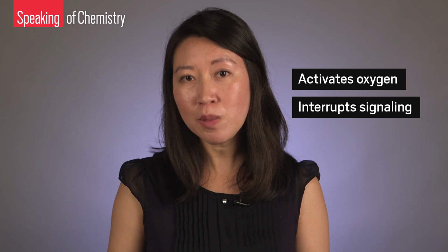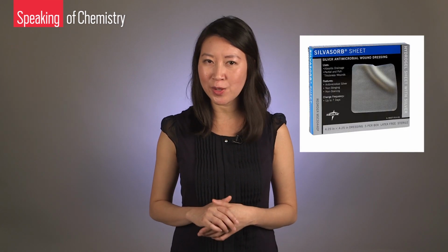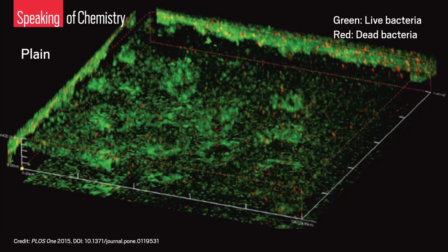So how does this bandage bust up biofilms and other bacterial infections? Findings from Chen's lab suggest that the electric field does 2 things. For 1, it activates oxygen and turns it into a bacteria-blasting missile. For another, it disrupts the signals that bacteria send to each other that say, hey, let's build a biofilm. We should note that some of these studies were partly funded by Vomaris. We also asked Chen about a potential wrinkle. Silver by itself is used as an antibiotic in a number of products today. So what if it's just the silver dots that are doing all the work? Chen says that's not the case.